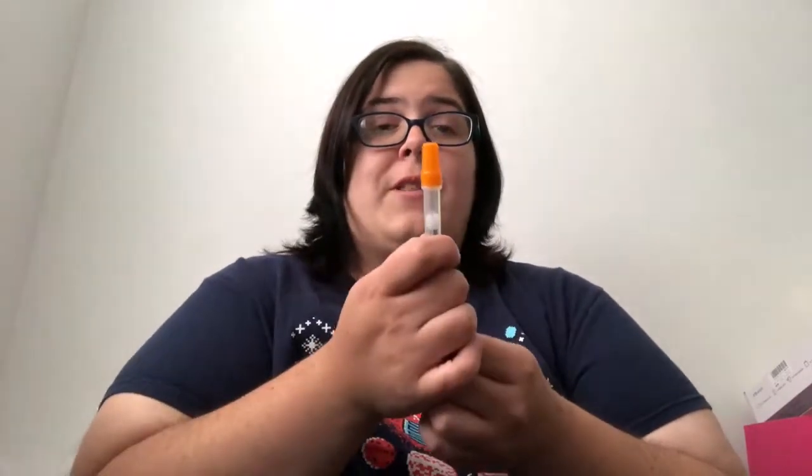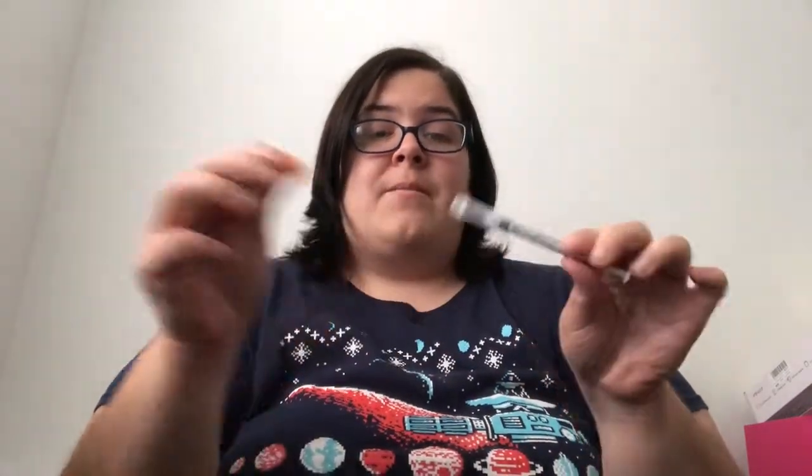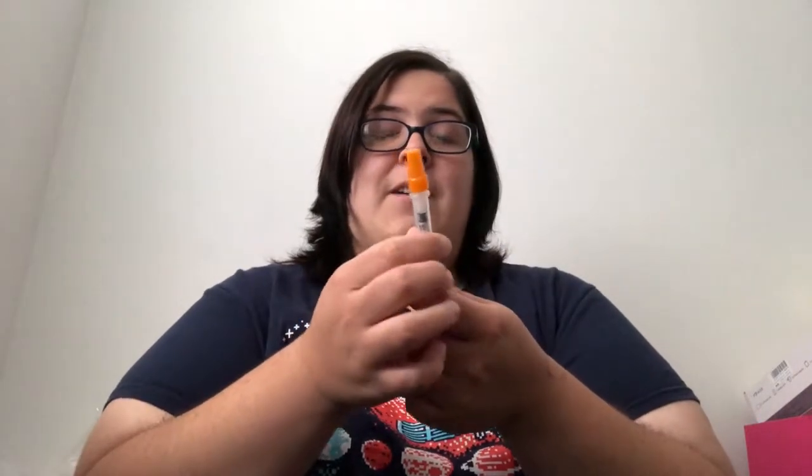Now, what I just did when I put this cap back on is I pushed up the plastic barrel at the same time that I put this on. But sometimes, when you're in the heat of the moment and you're busy and you're trying to get to your next patient, you're not going to think to hold this up and put this on at the same time. So it's safer to just take this, once the safety barrel is up, throw it in the sharps. And then you can throw this in there too if you want. But see what I mean? You put this lid on and it's already coming back down. So it's dangerous. Don't do it.